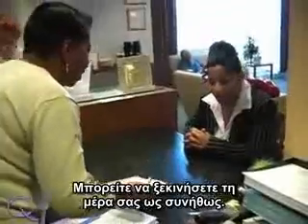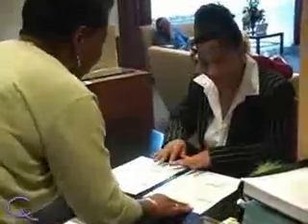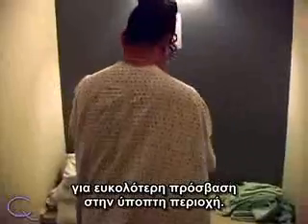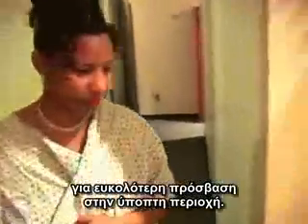You can begin your day as you would any other. Once you arrive at the exam center, you may be asked to put on a gown that allows the technologist easier access to the area of interest.